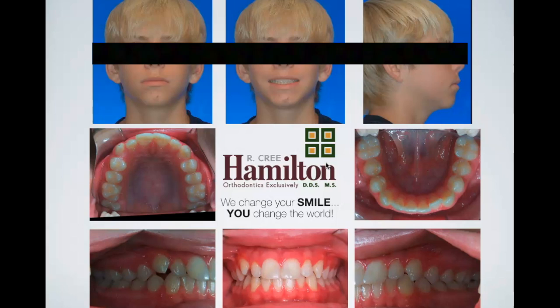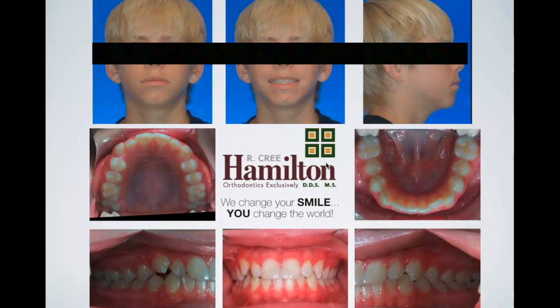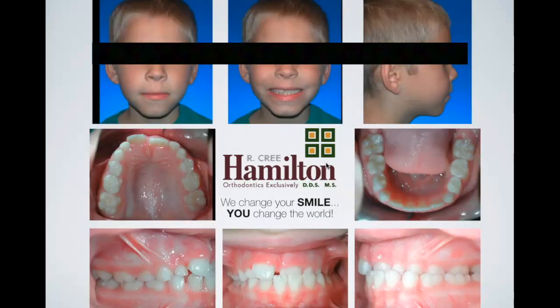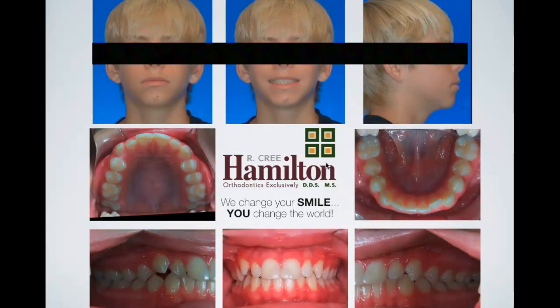Okay, so true, right? There's that. Now, granted, these time points are quite different, right? I mean, obviously, there's a number of years in between. This is between phase 1 and phase 2. So could the diastema have closed between then? Yes, but it's a good thought, right? Certainly, if you didn't see a diastema at all during your expansion, or that didn't get bigger, you would think more dental versus skeletal. What else?